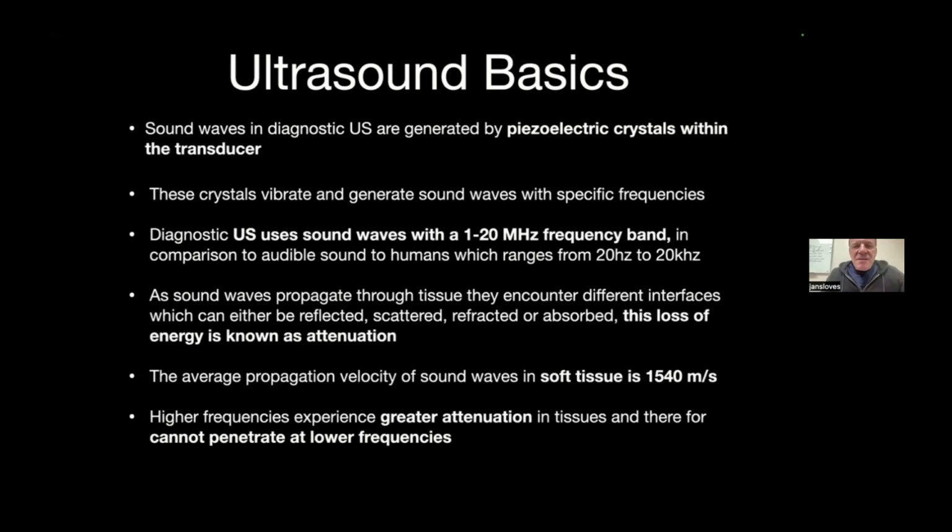So thank you so much, Jose. So let's get into some ultrasound basics.